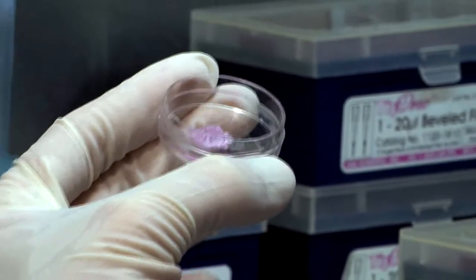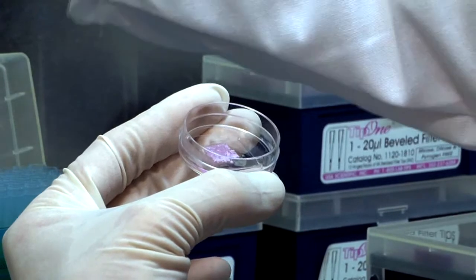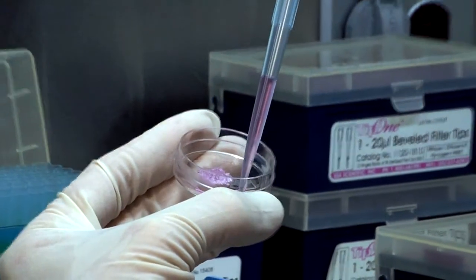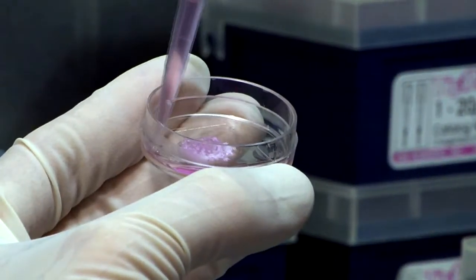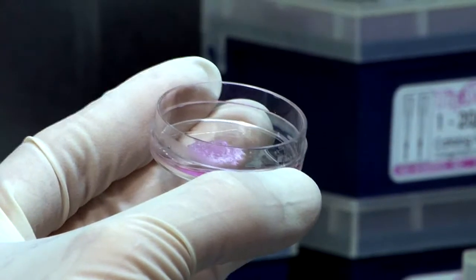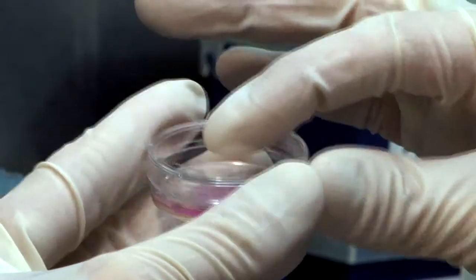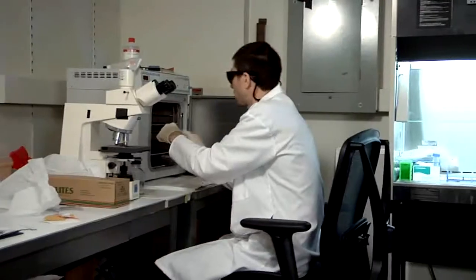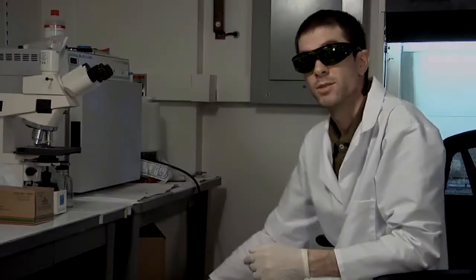Immediately after printing we add some media to keep the paper from dehydrating, but don't yet submerge the paper because the cells are still attaching and we don't want to wash them away. We just add a little bit of media around the outside, and then put it back in the incubator for five minutes. That's the whole process, and then you repeat that.